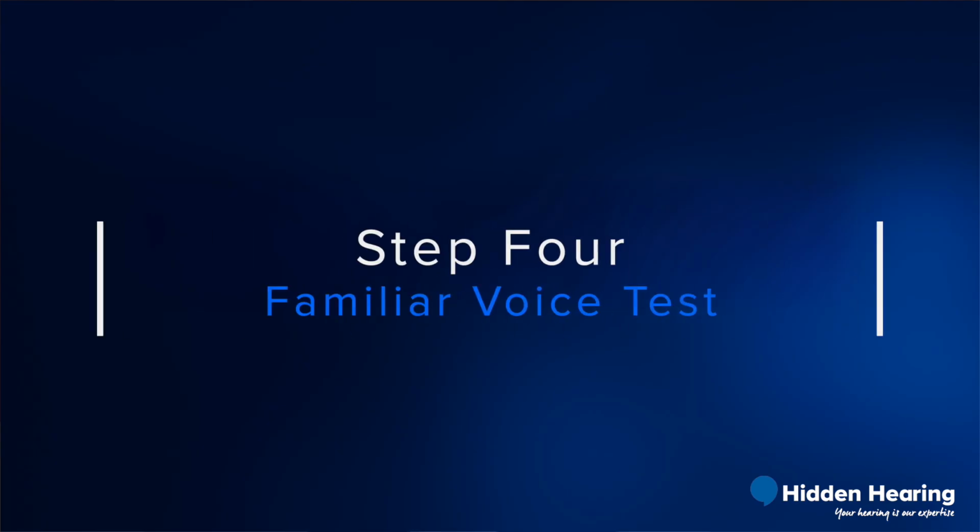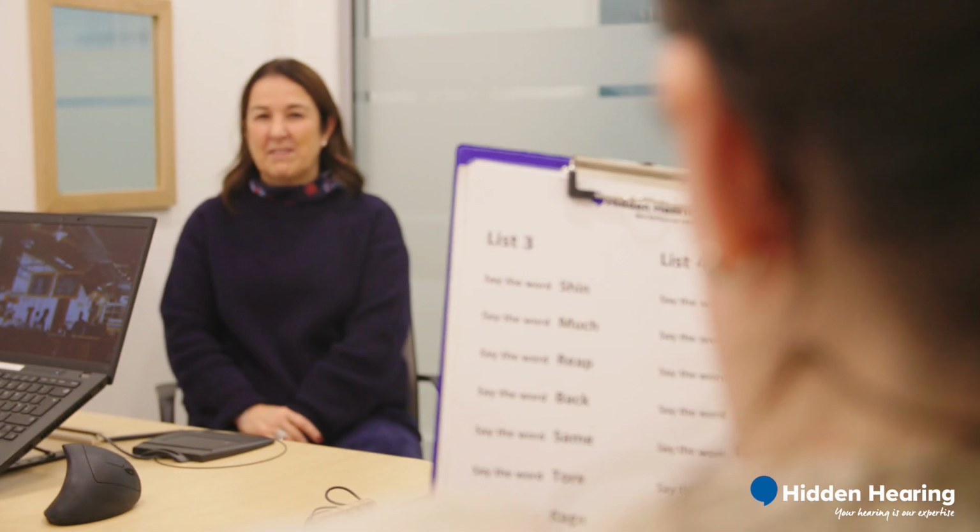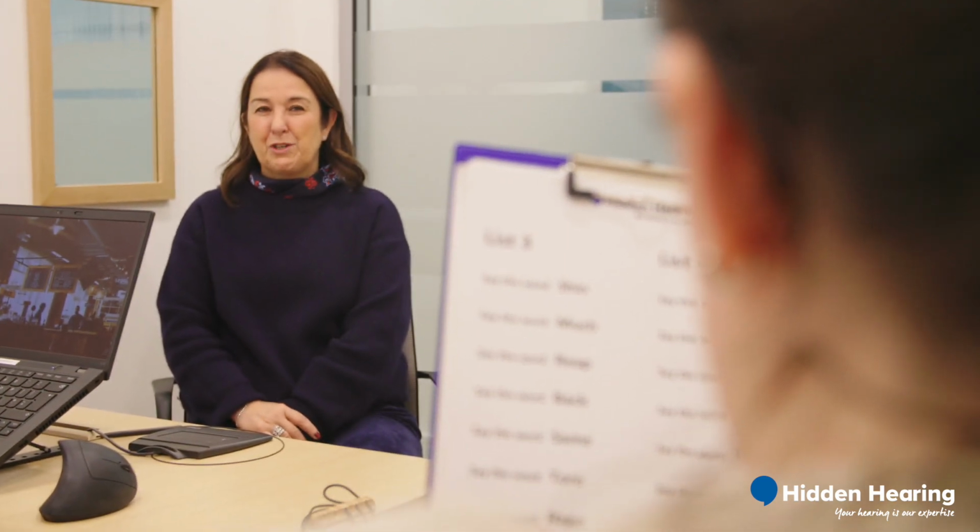Step 4 is the familiar voice test. So what we ask the testee to do is respond to words that their support is reading out from a list of words we give them. The list of words are read in background noise, and that is really to make it as close to real life as possible. This is a really important test because it's a real life test.